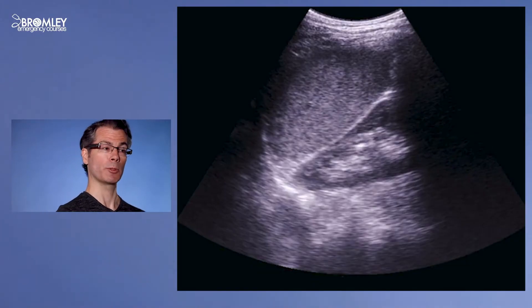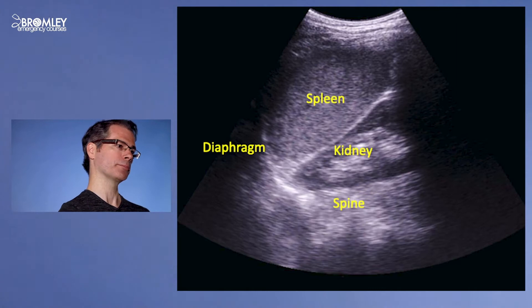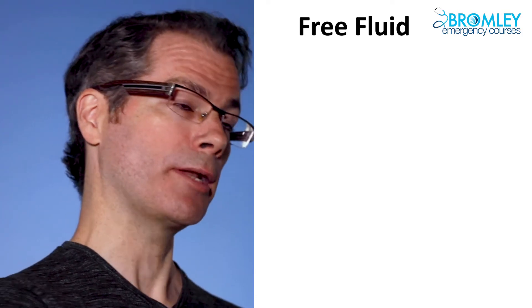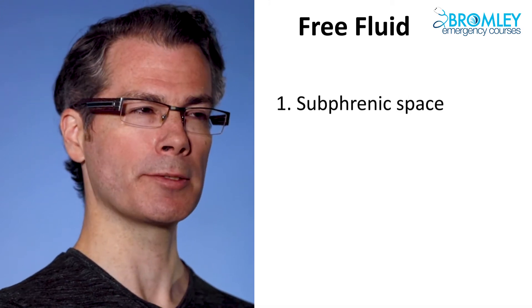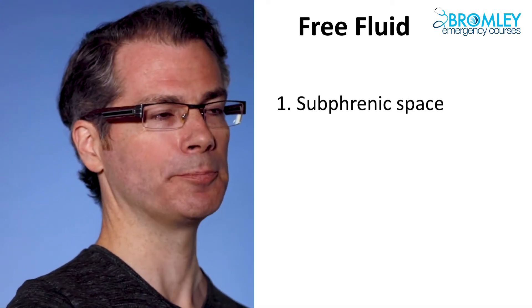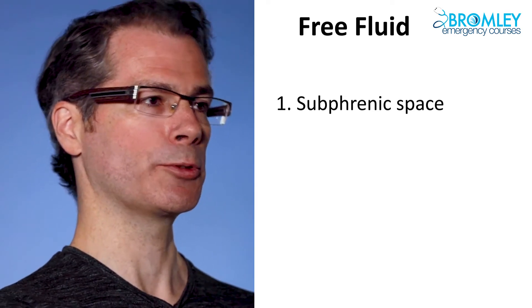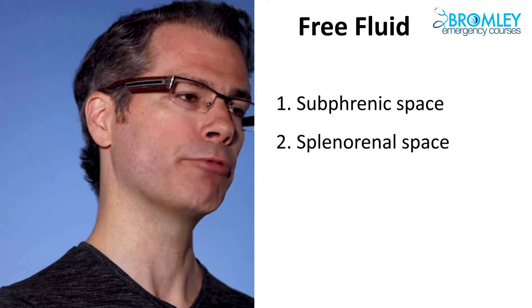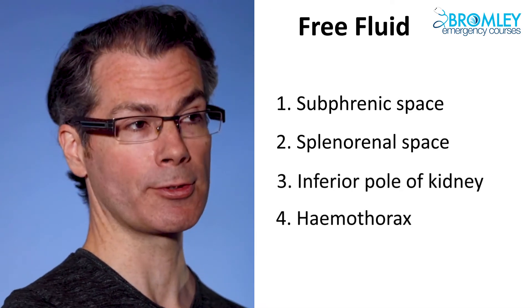Here's an image of a normal left upper quadrant. We have the spine at the back, the spleen at the front, the kidney in between, and the diaphragm towards the patient's head. Just like with the right upper quadrant, there are several areas where free fluid can collect. The main area in the left upper quadrant is actually above the spleen, in the subphrenic space between the spleen and the diaphragm. We also look between the spleen and the kidney — the splenorenal space — the inferior pole of the kidney, and slide up to look for hemothorax on the left.